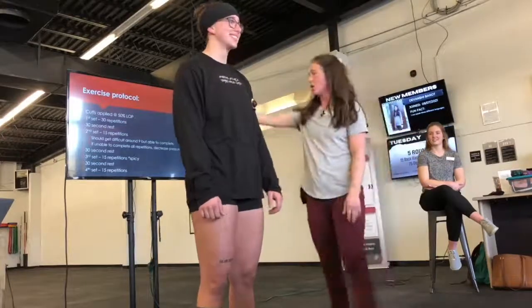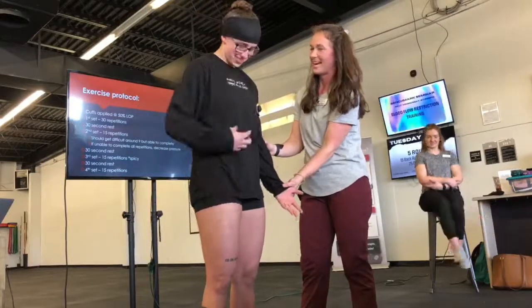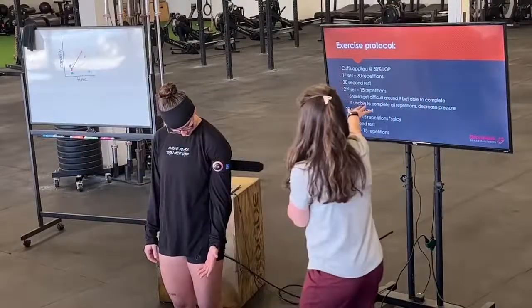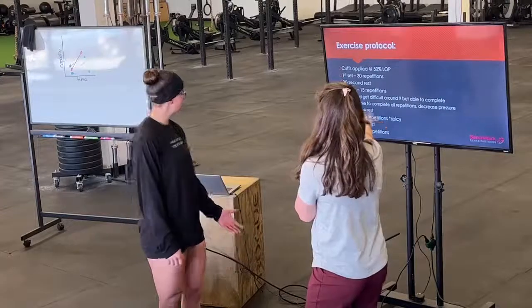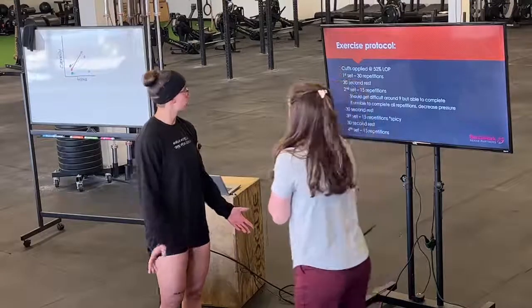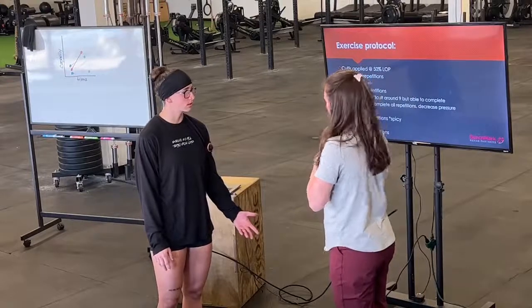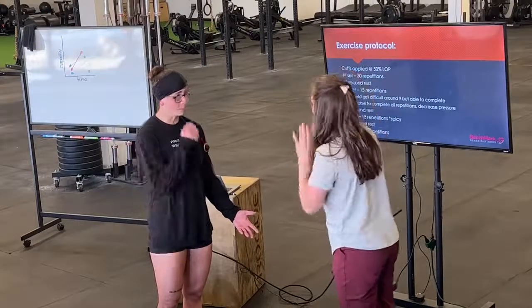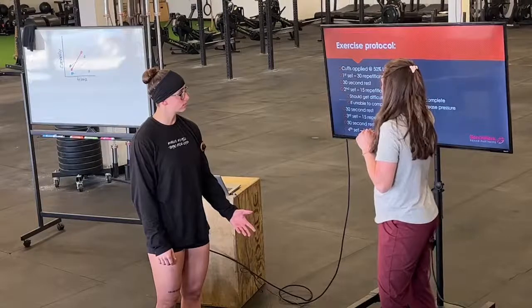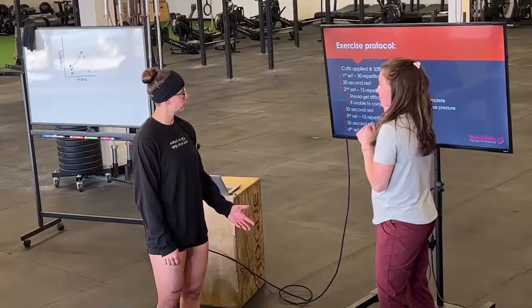Okay, so standard protocol is, hold on. We're treating your bicep, okay? So we're going to work through a set of 30, rest for 30 seconds, a set of 15, rest for 30 seconds, a set of 15, rest for 30, a set of 15, okay? First set of 30, you're just doing some bicep curls with no resistance, right? Because this is where we can work without resistance and still meet our strength goals. So for your first set of 30, this should be fairly easy. We should start seeing some fatigue in this second and third set though, okay?